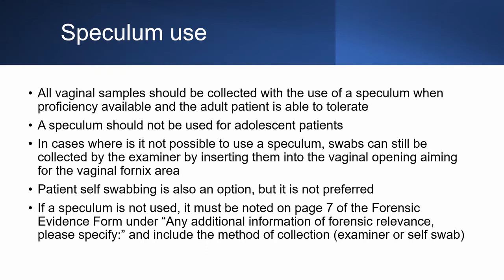Patient self-swabbing is also an option, but it is not preferred. If a speculum is not used, it must be noted on page 7 of the forensic evidence form under any additional information of forensic relevance please specify, and include the method of collection here, examiner or self-swab.